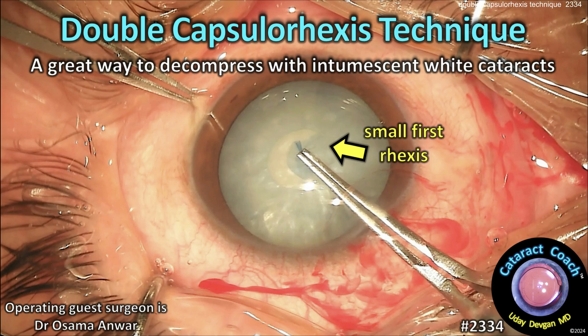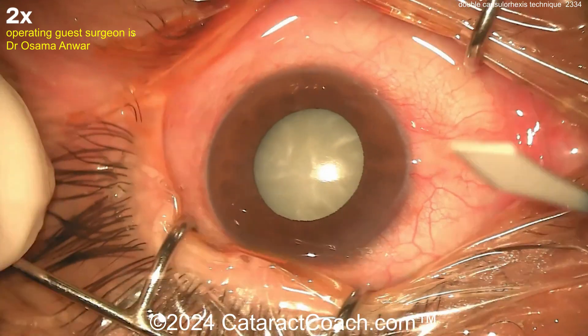CataractCoach.com — the double capsulorrhexis technique. We've done this before. It's a great way to decompress with intumescent white cataracts.